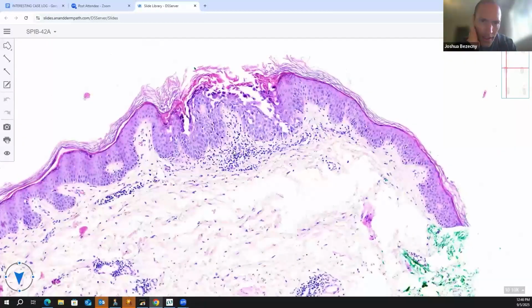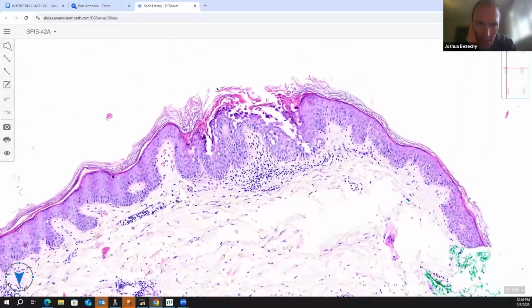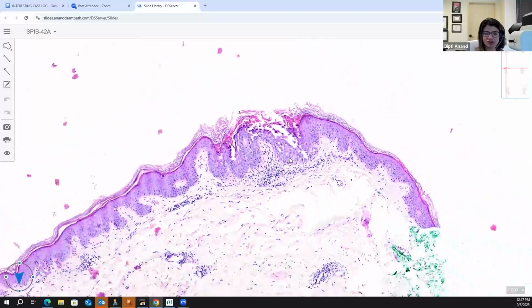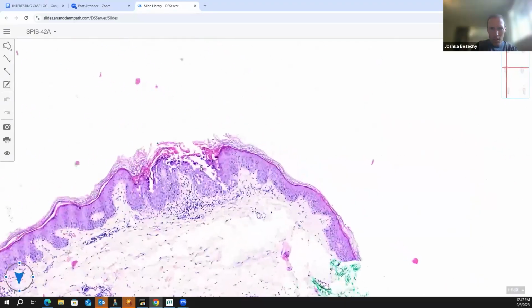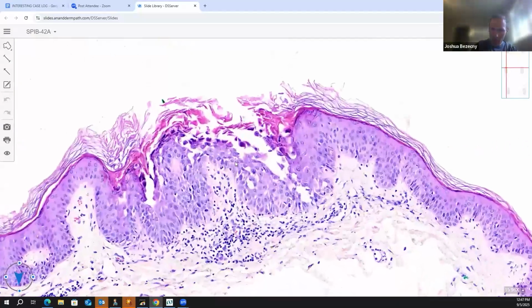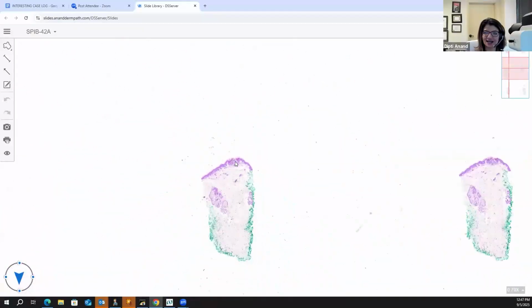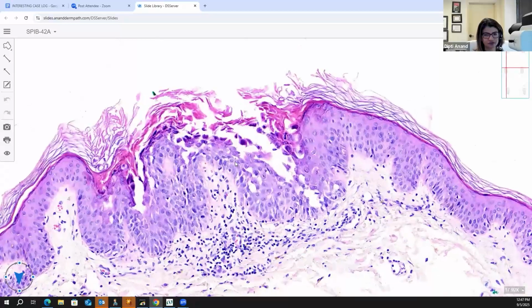So I could see just some focal acantholysis, some dyskeratosis, corps ronds and corps grains. So I was leaning towards Darier disease on this one. Which one, Darier or Grover's? I was a little bit more towards Darier's, but I guess you could say Grover's too, because it's a pretty isolated papule. Yeah. So why did you favor Darier, just out of curiosity?